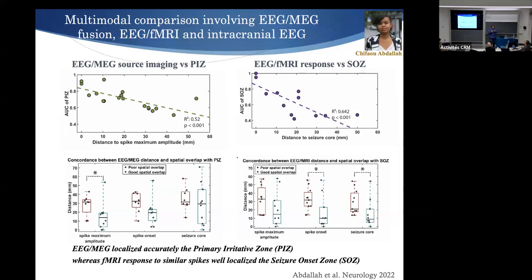And that's also the same reason when Jean was talking about the spike onset zone, which is typically where you have a spike that generates in the hippocampus, propagates to the scalp, and then you measure it. In EEG-fMRI you get a bit of the lateral regions, but you get mainly the origin. So this is also the change between the two modalities. We have one modality that is sensitive to metabolism and blood flow, and the other one that is sensitive to synchronization of neuronal activity.